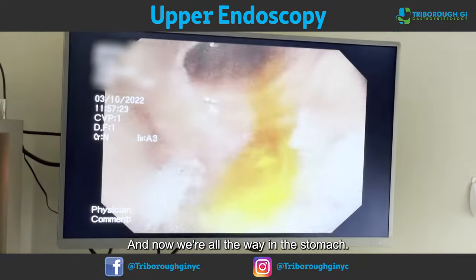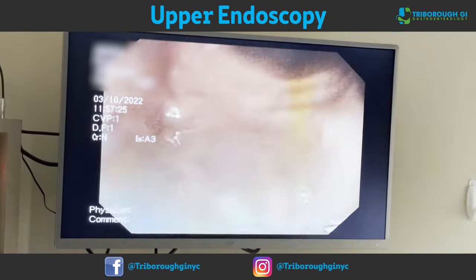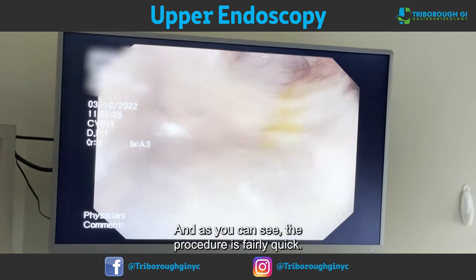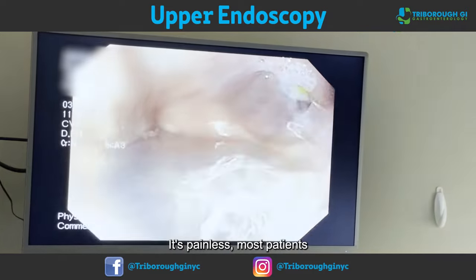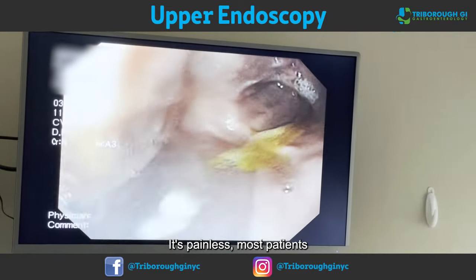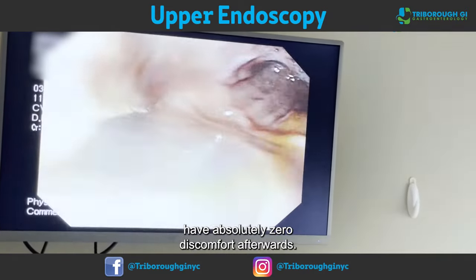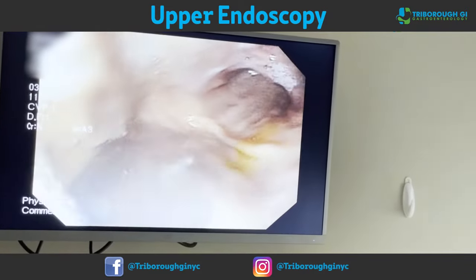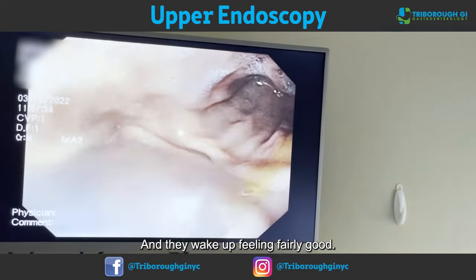Now we're all the way in the stomach. As you can see, the procedure is fairly quick. It's painless. Most patients have absolutely zero discomfort afterwards and they wake up feeling fairly good.